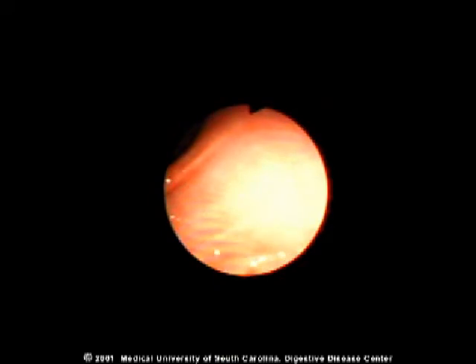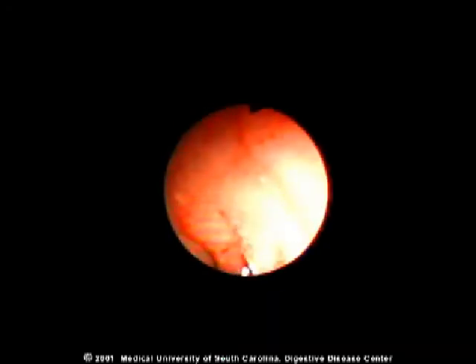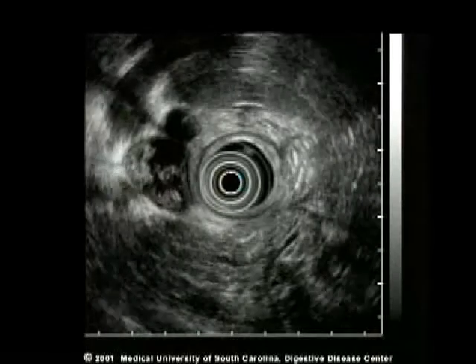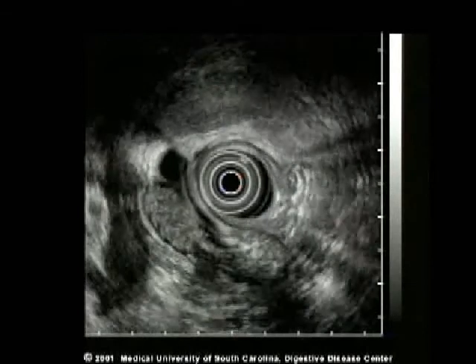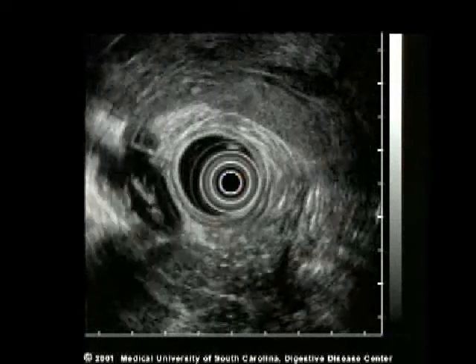To image bile duct masses, the transducer is placed in the duodenal bulb. By impacting the transducer near the apex of the duodenal bulb and pushing inward slightly, the common bile duct, portal vein, and pancreatic duct can be seen. In this case, a large sausage-shaped mass is seen within the common bile duct. A stent is seen coursing through the center of the mass as two bright, hyperechoic lines. Note that the mass does not extend outside the wall of the bile duct into the pancreatic parenchyma.